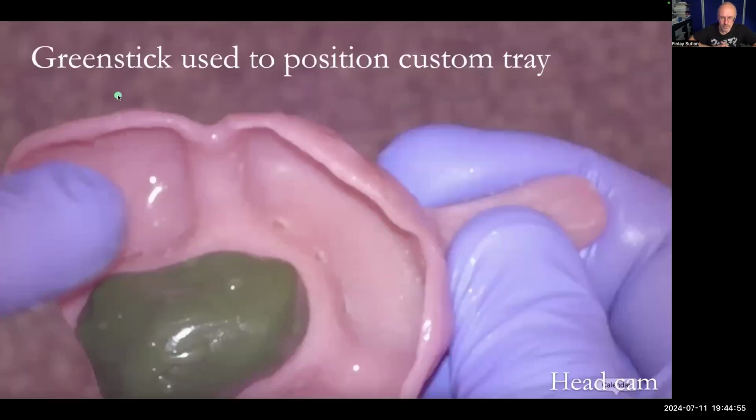So next, what I'm going to do now I've prepped all of the upper teeth and got them ready for doing the working impressions. And by the way, I don't really do many rest seats for these overlay type dentures, where they are splints that sit over the teeth. So I put green stick in the center of the custom tray, the special tray there, warm the green stick up, and then pop that into the mouth. And when that is soft, it means I can center the tray, line it up with the frenum, just get it centered nicely.